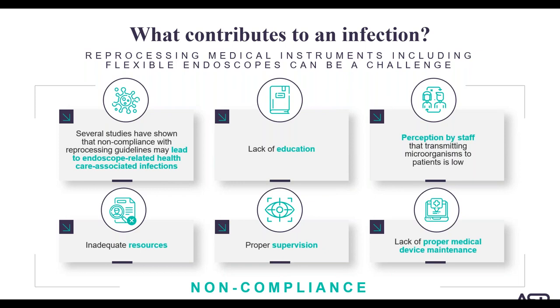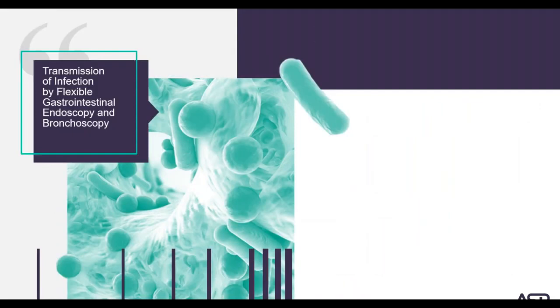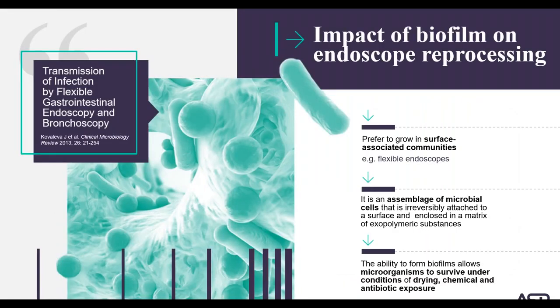Lack of maintenance on the device. Remember, these devices are black and fairly complex. Don't assume just because a bronchoscope is working, it's safe for use. There are many variables that can affect a bronchoscope's integrity. And what's one of those things?